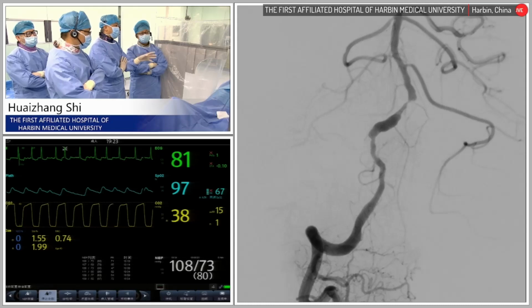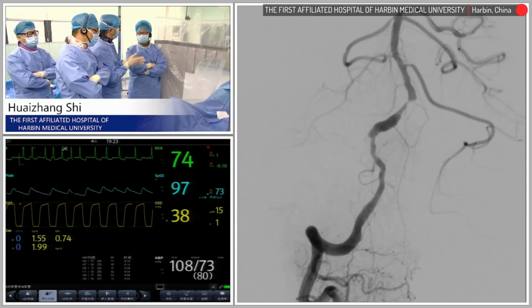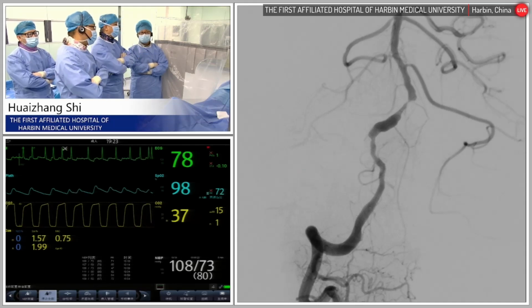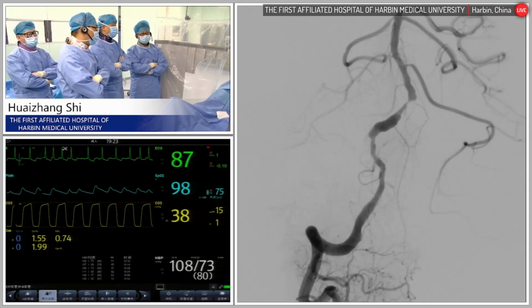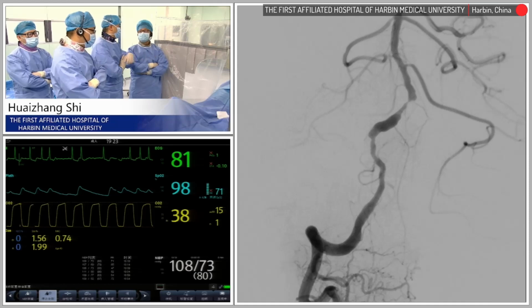The balloon catheter, we can navigate the stent from the... balloon catheter. So it's very easy. And it's much better than the traditional catheter. Yeah, I see, got it.